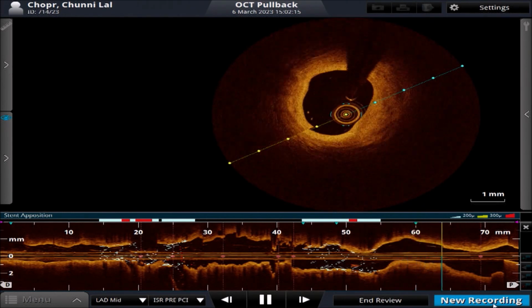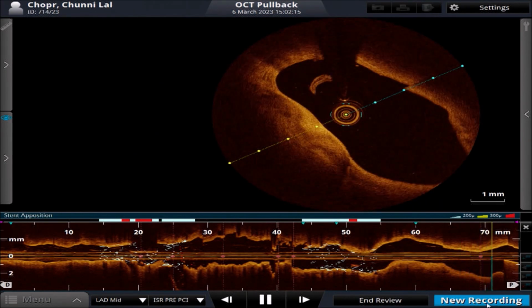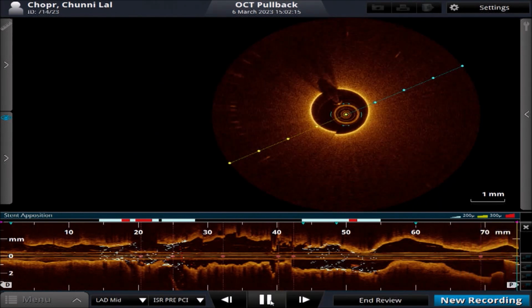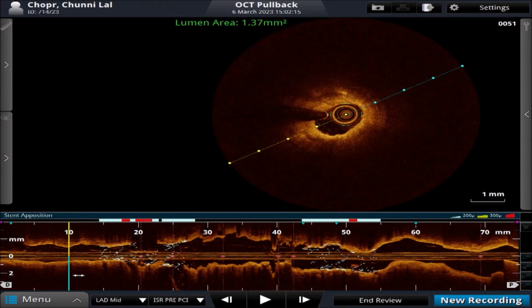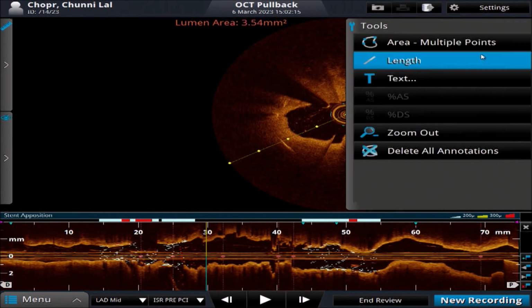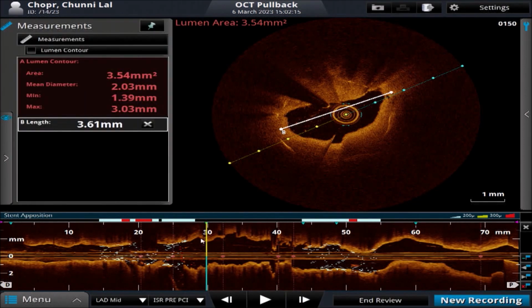The proximal LAD has also been calcified, and the mid LAD of course now has an aneurysmal segment. What's the etiology of this aneurysm can be very well discussed among the panelists. For the timing, let me go ahead and dilate the in-stent restenosis segment with the 2.75 millimeter cutting balloon. We do have a reference vessel distally of 3 millimeter.